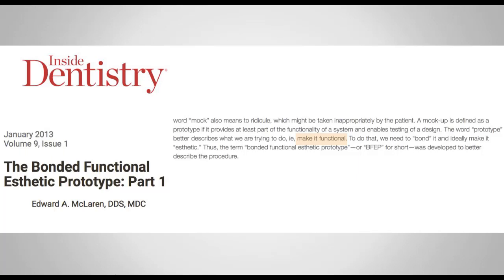To be honest with you, I'll show you one case at the end where I use this type of prototype to develop crowns, not only veneers, wrapping the whole tooth with flowable composite and sending my patient home so that I can really evaluate any occlusal issues, or the new incisal position or the new occlusal scheme that I've developed for patients that have excessive wear or that need an occlusal vertical dimension increase.